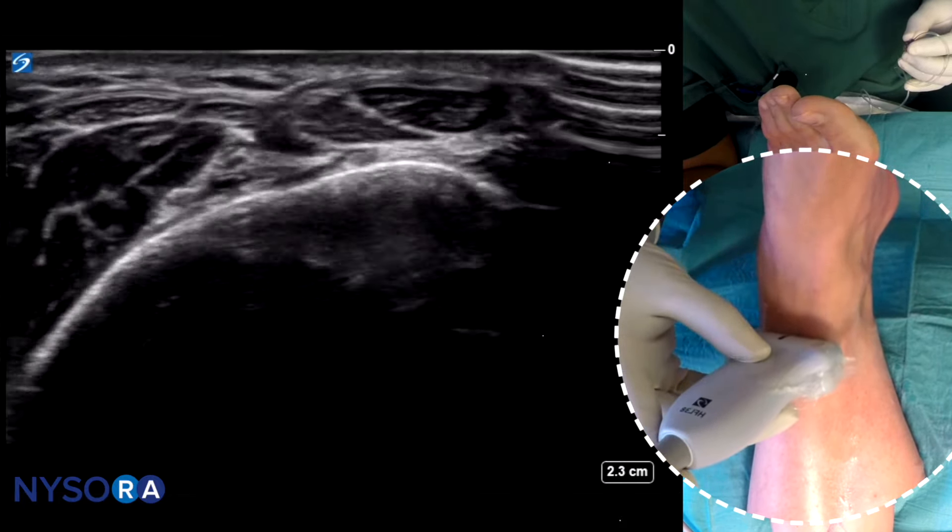The nerve will always be on the lateral side of the artery in 95% of cases. As you scan proximal to distal, the nerve tends to actually climb up over the lateral wall of the artery. Let's see that one more time — there it is.